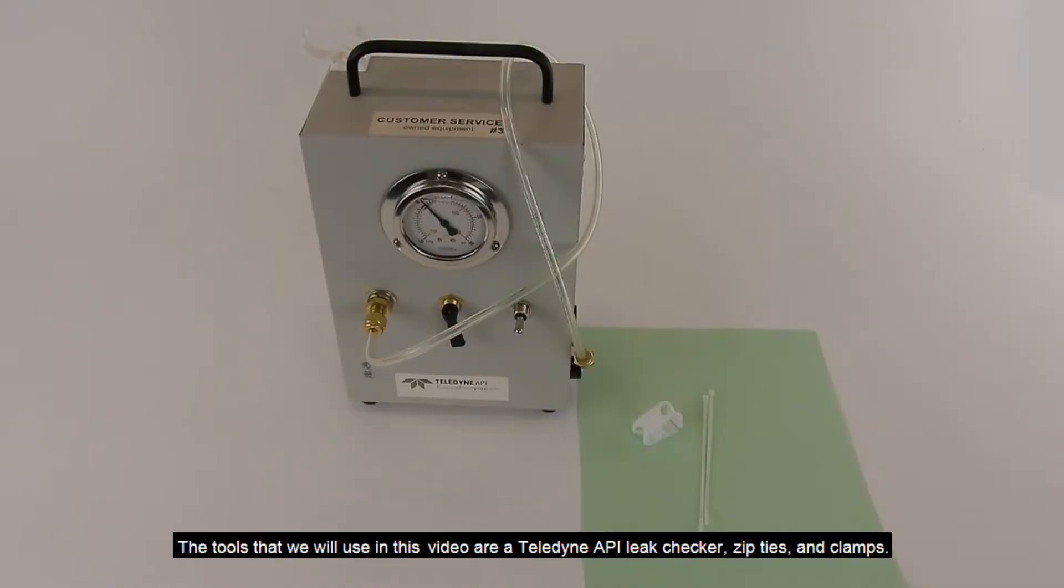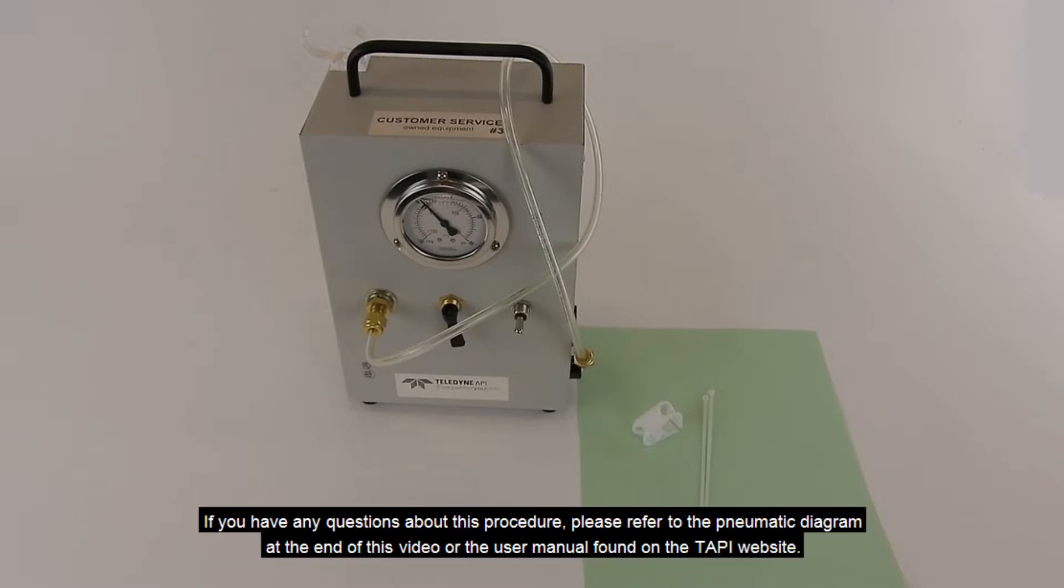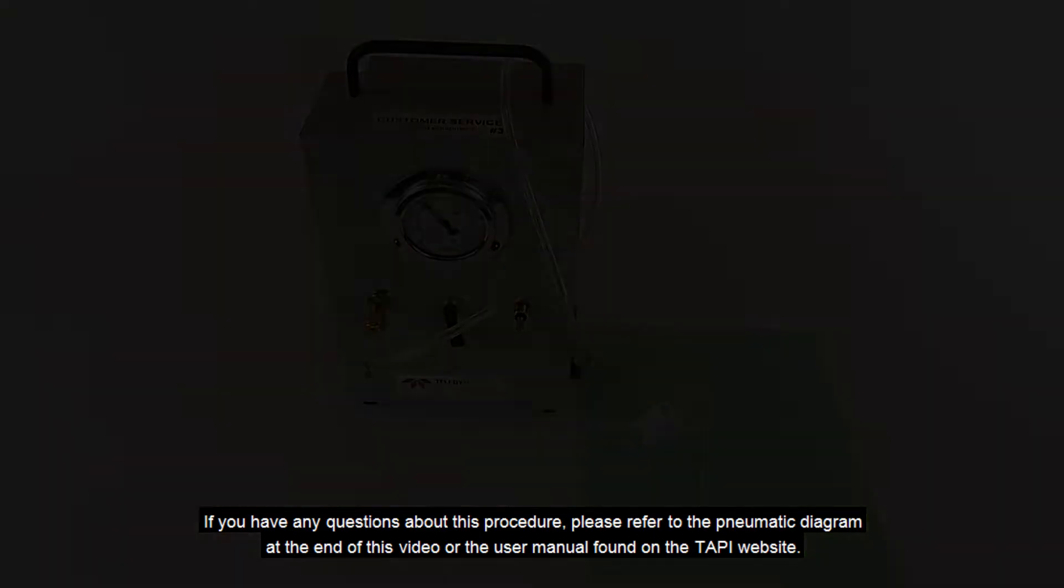The tools we will use in this video are a Teledyne API leak checker, zip ties, and clamps. If you have any questions about this procedure, please refer to the pneumatic diagram at the end of the video or the user manual found on the website.